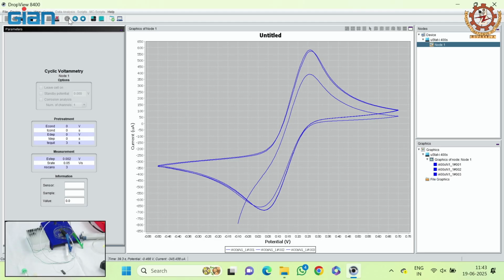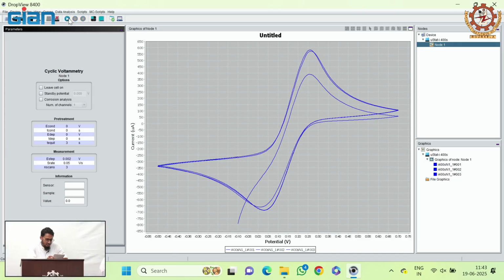So just to repeat, for this CV we have used E begin at minus 0.1 volt, EVX1 at 0.7 volt, EVX2 at minus 0.5 volts. The scan rate was 0.05 volts per second, each step was 0.002 volts or 2 millivolts, and the number of scans were 3.